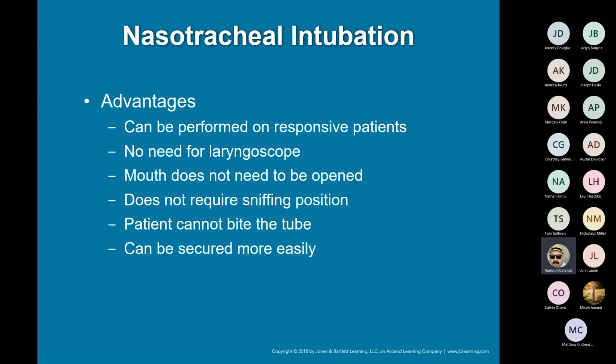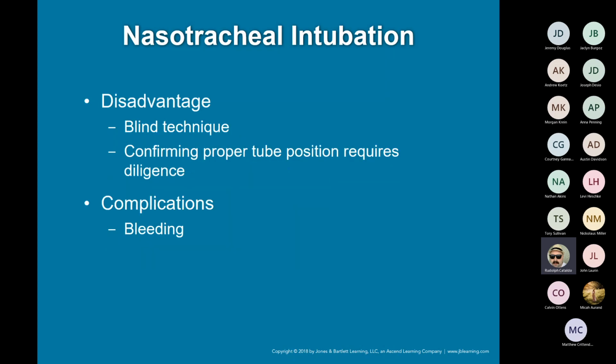In the instance, I believe the patient that I had, I believe their jaw was wired shut due to trauma. So that's why they opted to nasotracheal intubate this patient instead of having to perform something such as a cricothyrotomy, either an open or simple.